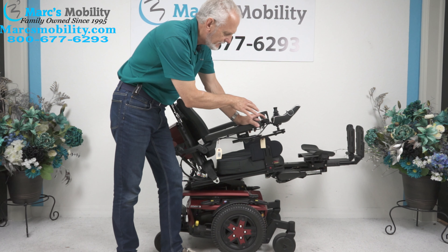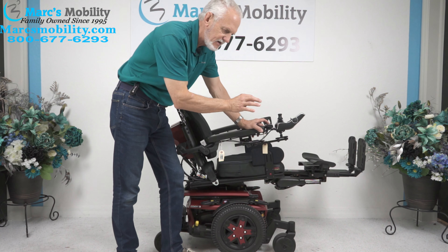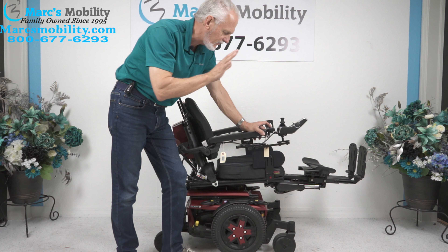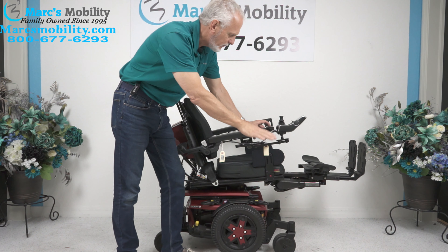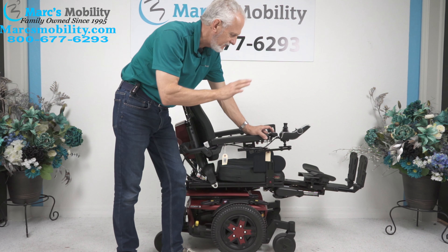These buttons — it's the same button. If you hit it, it'll go down. If you hit it again, it'll go back up. So if I hit that same button now, it goes back up. If I hit it again, it'll go back down. So it's the same button for up and down.